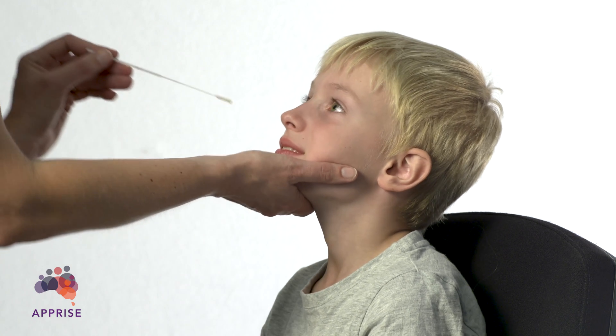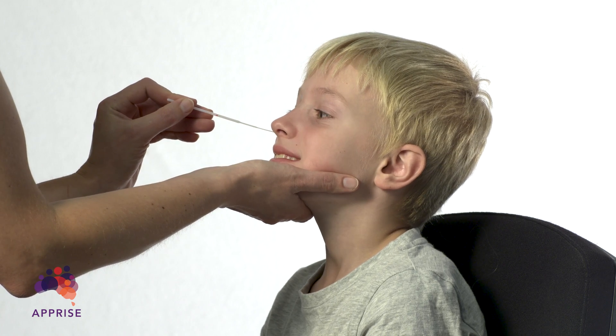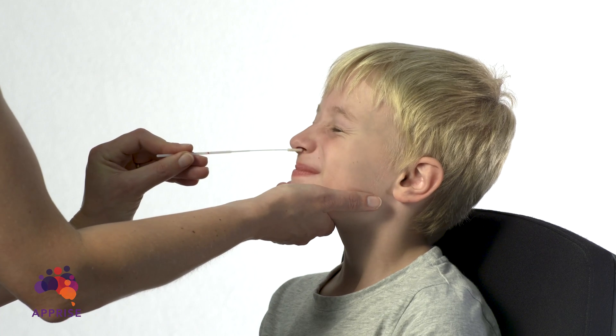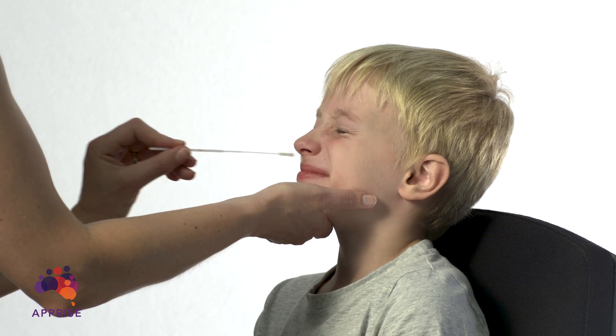Using the same swab, insert the swab tip into your child's nostril and push it in a few centimetres until you encounter resistance. Leave the swab in place for a few seconds and then slowly remove it using a rotating motion. Repeat in the other nostril.